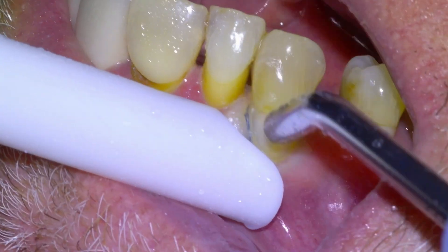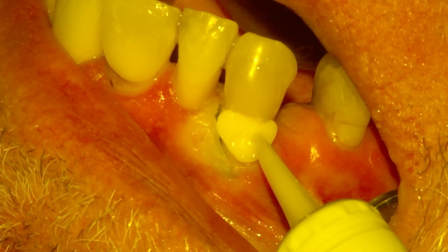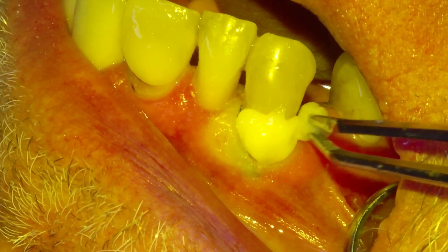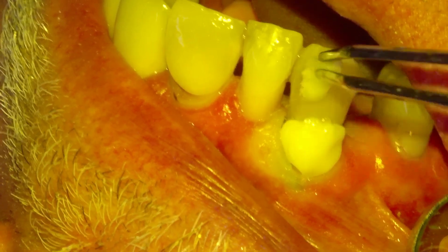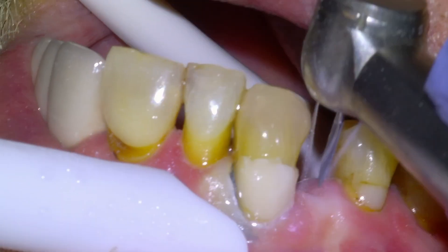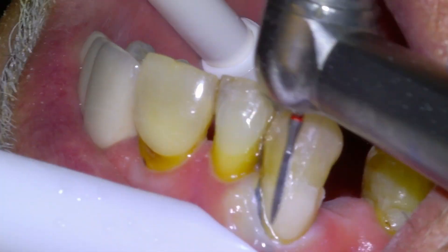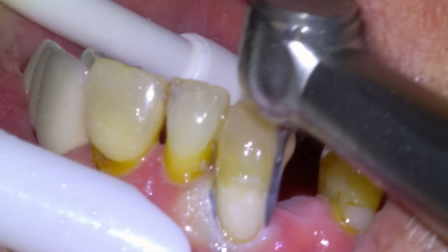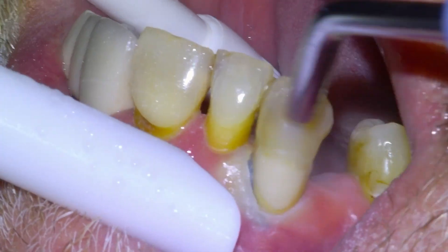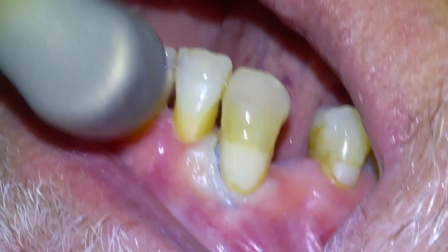We're going to restore the tooth by starting to etch with 35% phosphoric acid for about five seconds, rinse thoroughly, dry it off, and then add our restorative material — this is Fuji 2 light cure. I'll overfill the cavity and then adapt the restorative material to the margins with a moist cotton pellet. Jackie's going to light cure that, and then we're going to begin removing the excess restorative material with a high-speed carbide flame bur from Brasseler until we're back down on natural tooth.